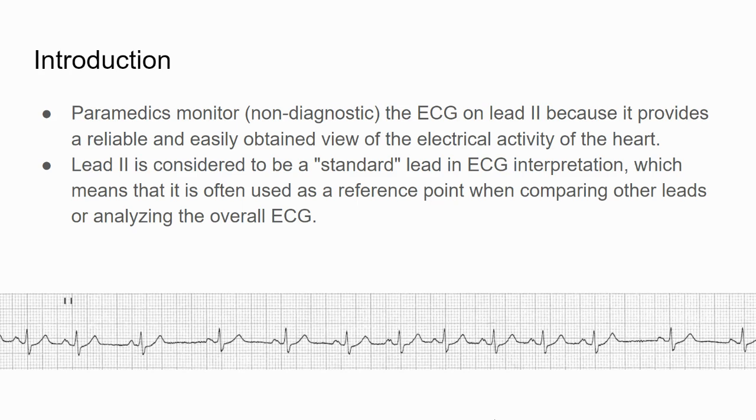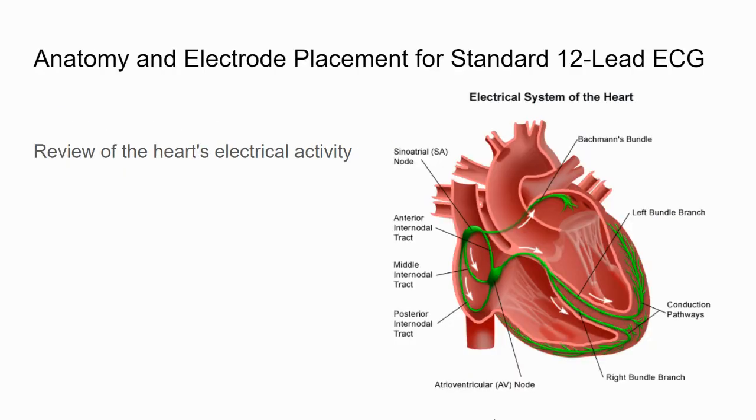So I do recommend, let's just say you only have one lead that you're viewing on the monitor just to monitor the patients, place it so that you're on lead 2, for example, not on lead 1 or lead 3.